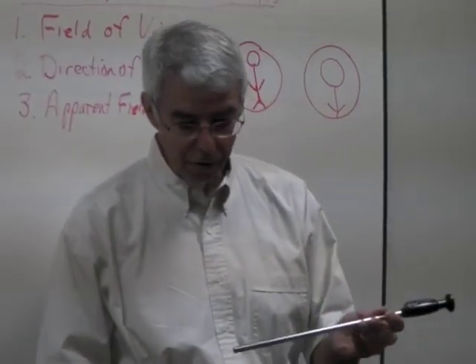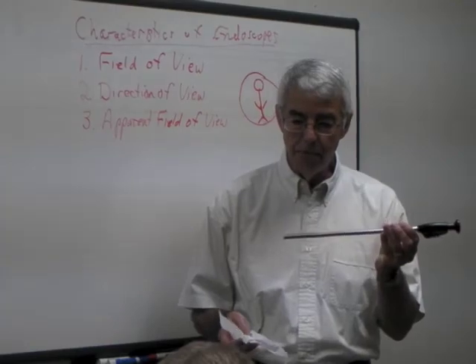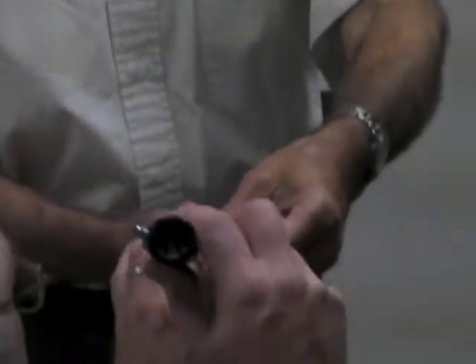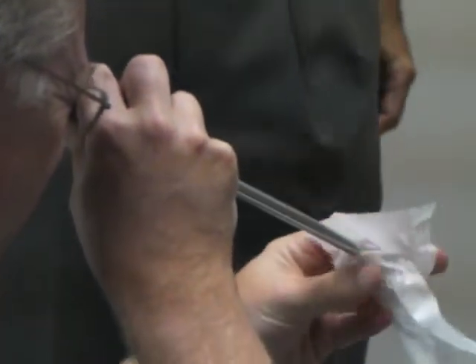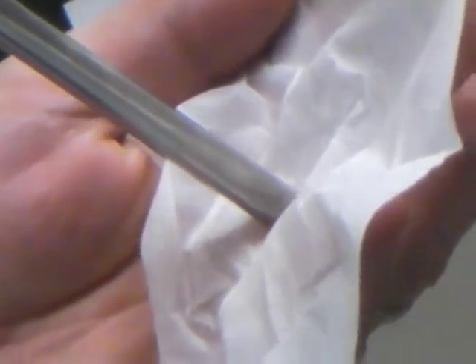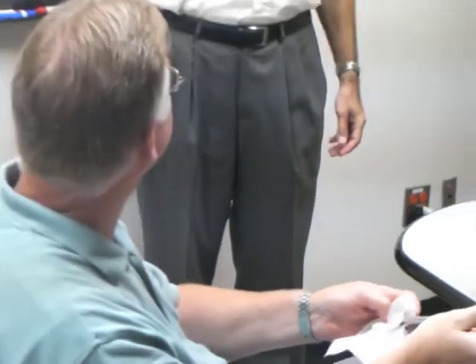Okay, so now I want to pass this laparoscope around. Have you do the same thing. Tell me what you see there. Is that 10 millimeter? That's a 10 millimeter. Circle. Any difference between the circle and the arthroscope? It's bigger. That's the right answer.